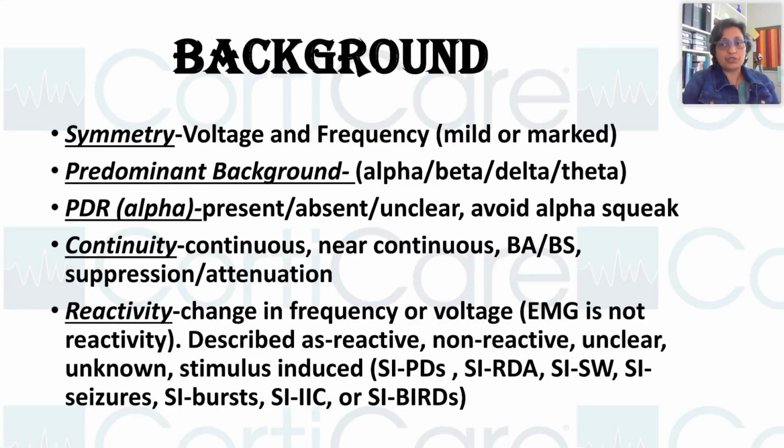What is the continuity of the pattern? Is the pattern continuous, near continuous? Either it is burst suppression or attenuation. We will talk about that as we go along.